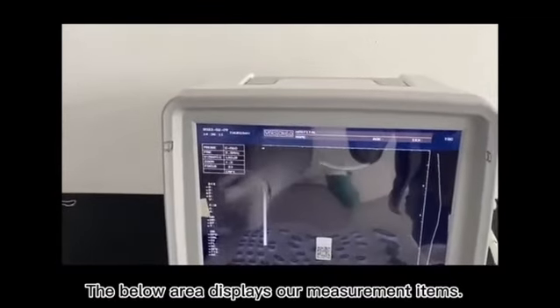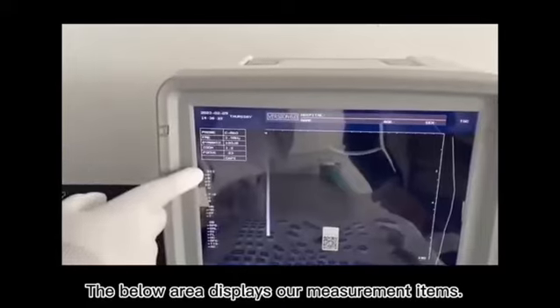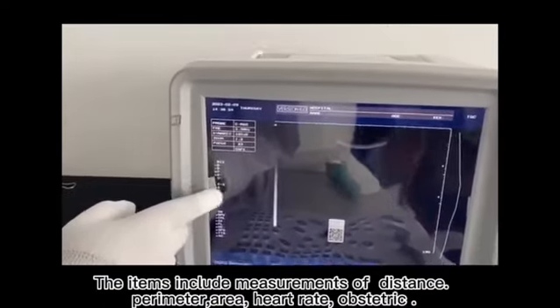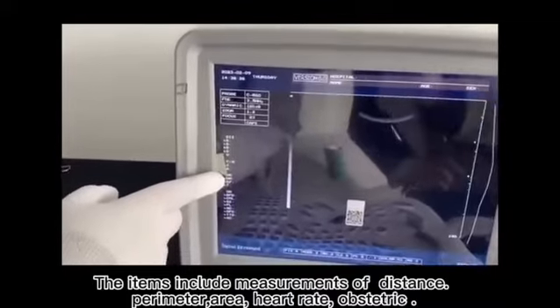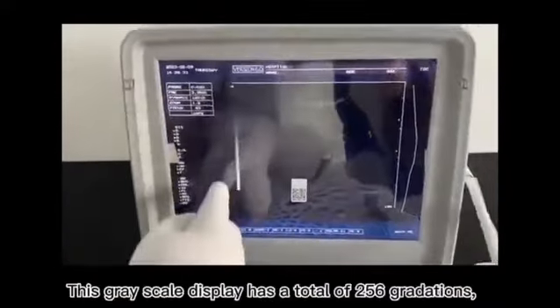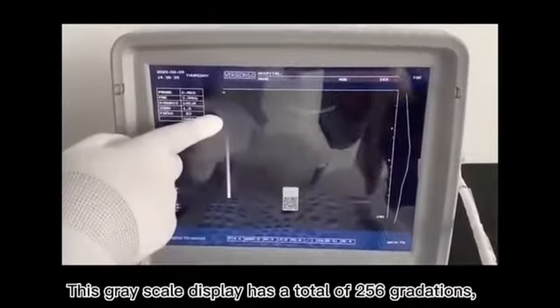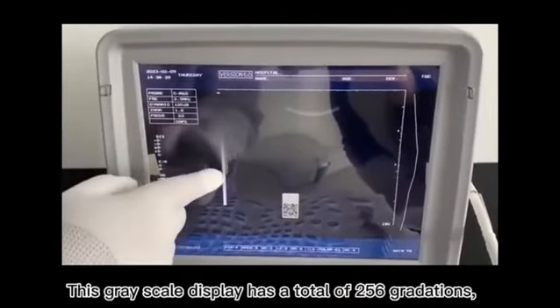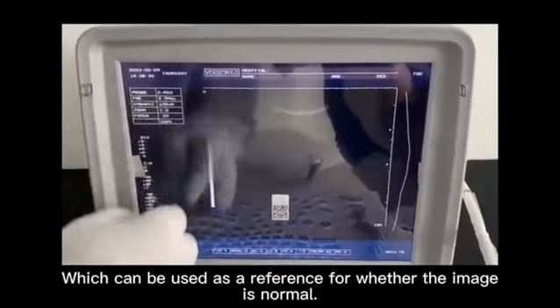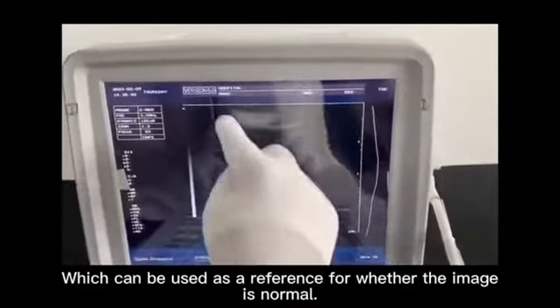The below area displays our measurement items. The items include measurements of distance, perimeter, area, heart rate, obstetric. This grayscale display has a total of 256 gradations, which can be used as a reference for whether the image is normal.